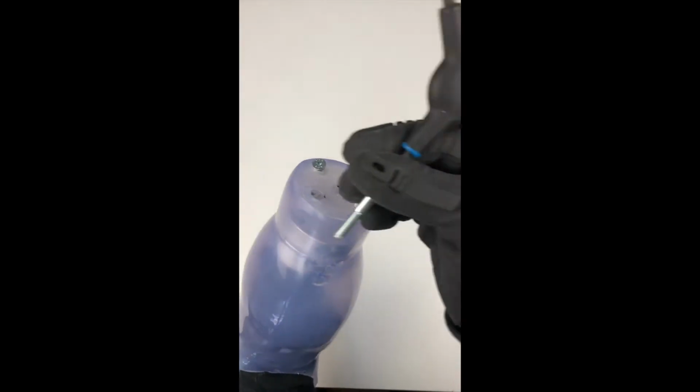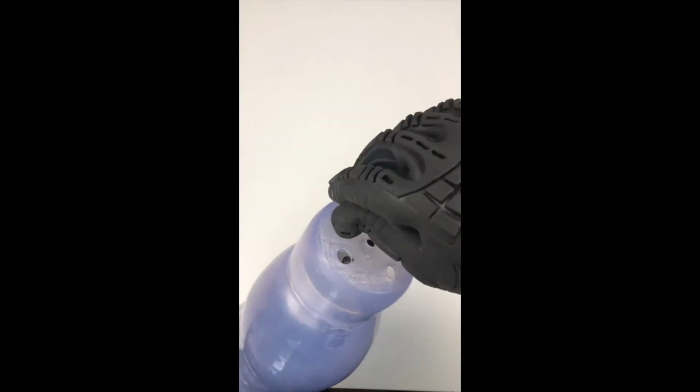Remove the 40mm screws from the molding dummy. Slide your hand inside the socket to prevent the molding dummy from falling and getting damaged.